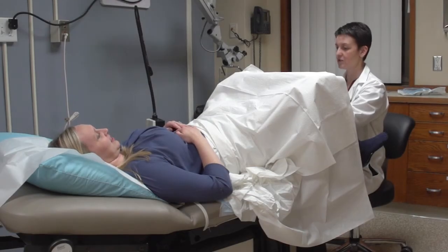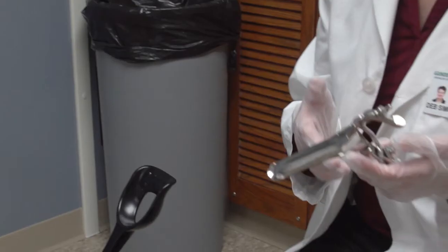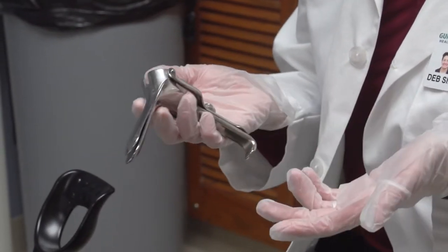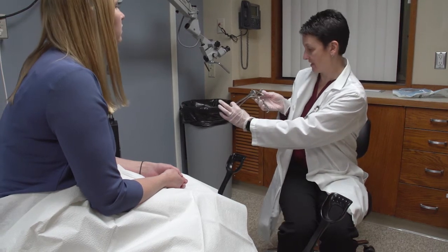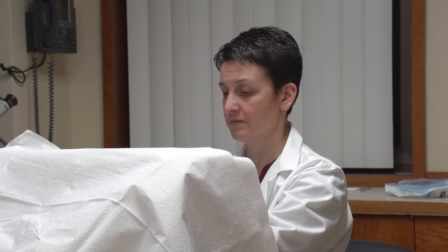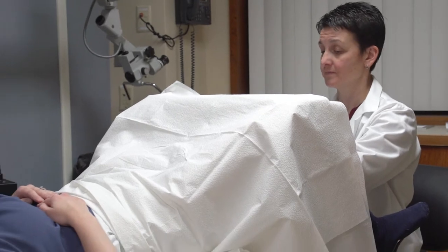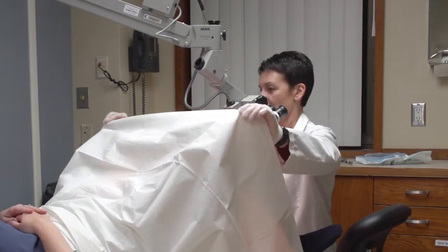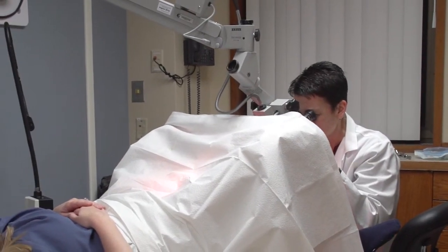During the procedure, you'll lie on the exam table just as you do for a Pap test. The healthcare provider will use a speculum, a medical term for an instrument that holds the vaginal walls open, to see the inside of the vagina and the cervix. A vinegar solution is applied to the cervix to make the abnormal cells easier to see. You may feel pressure or a slight burning for a few moments. Then the colposcope is placed outside the vagina and the cervix magnified.